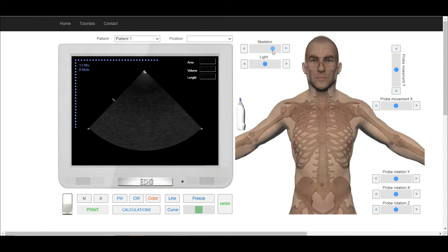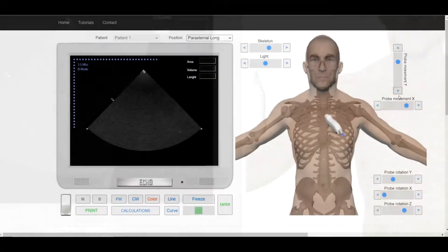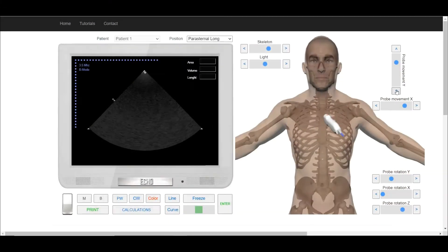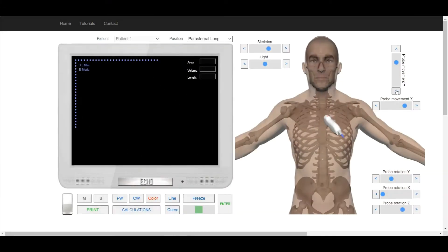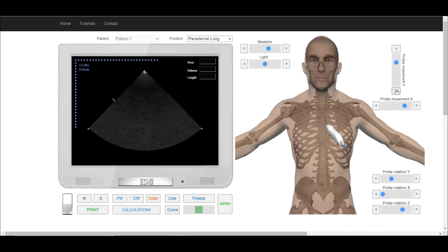For the left parasternal window, place the transducer in the third or fourth intercostal space on the left side, right next to the sternum.